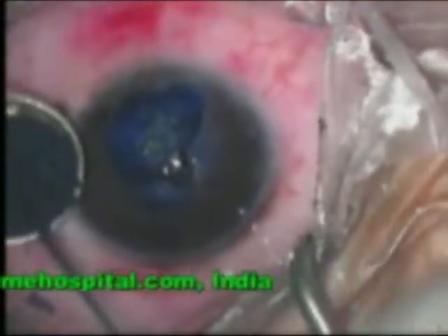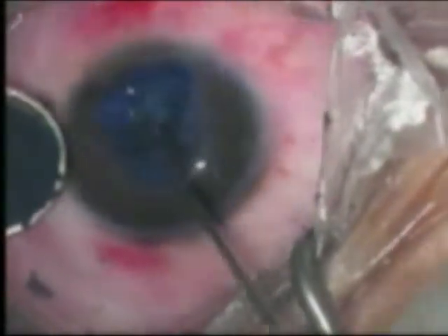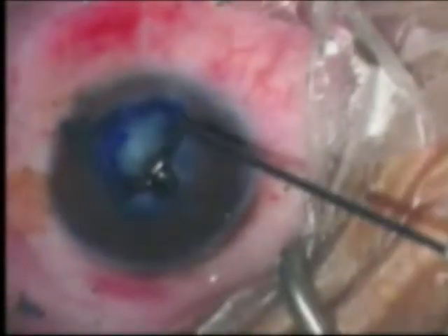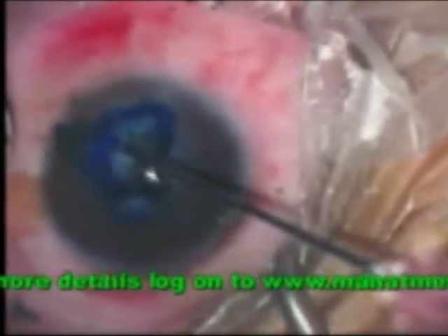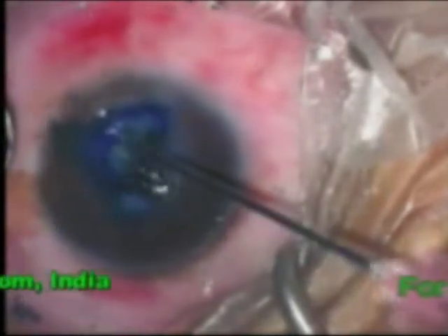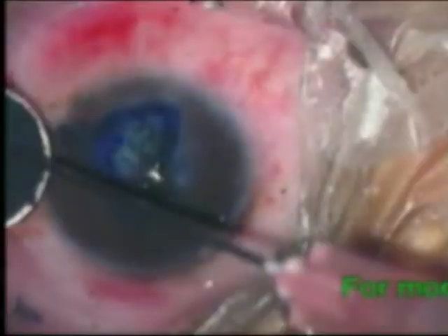Multiple needle punctures are then made in such a way that the pigment penetrates deeper, but there should be no perforation. So, the needle should be oblique and move in different directions, but it should not go beyond the superficial 1/3 of the cornea. Let us now see the lamellar resection technique for tattooing.